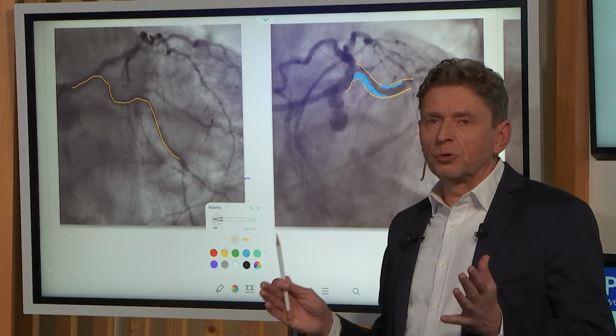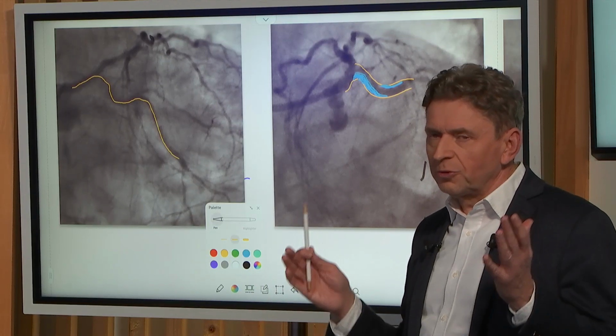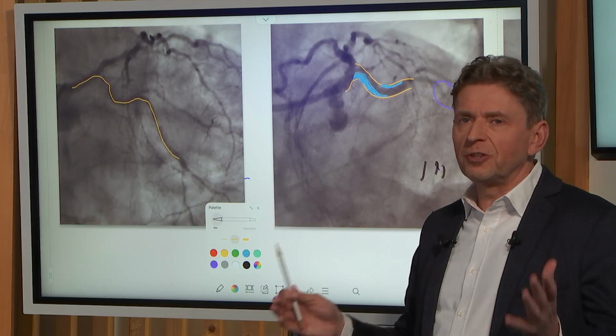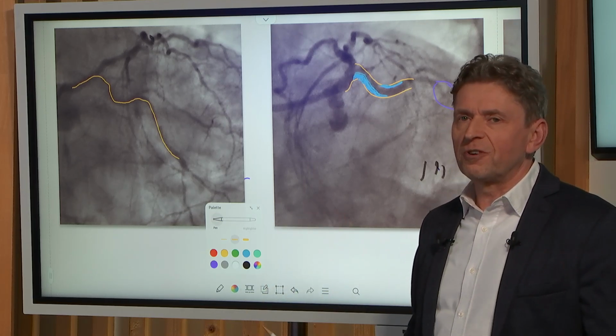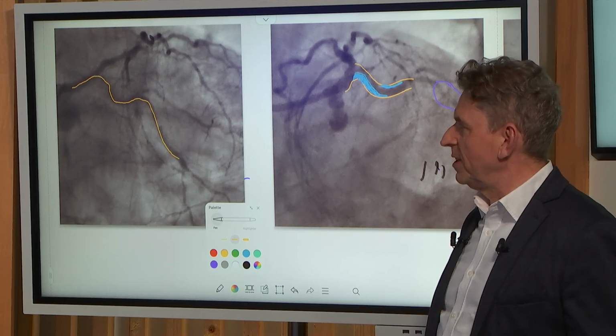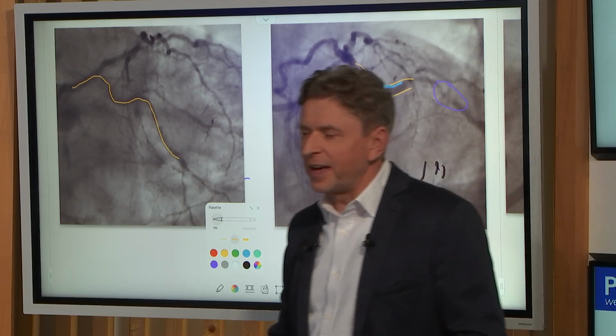Definitely. Imaging is crucial here. I can tell you we wanted to start with imaging with IVUS, but we were not able to get the catheter down to this lesion. So before imaging, we had to prepare the lesion, and I will show you in my next slides how we actually approached this anatomy.